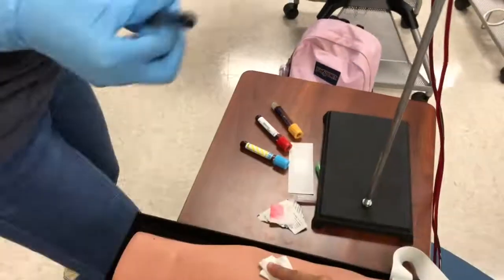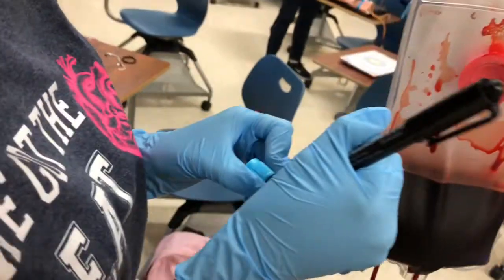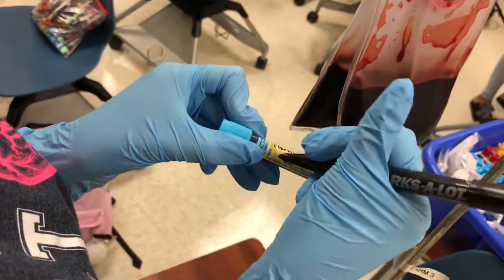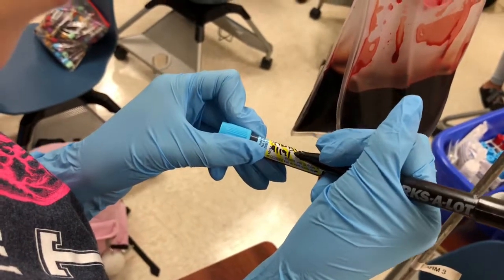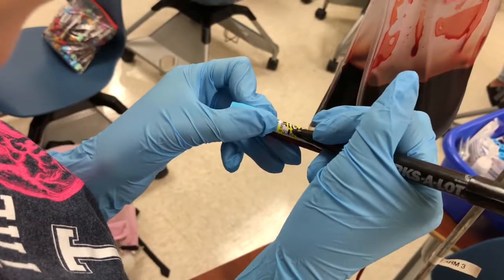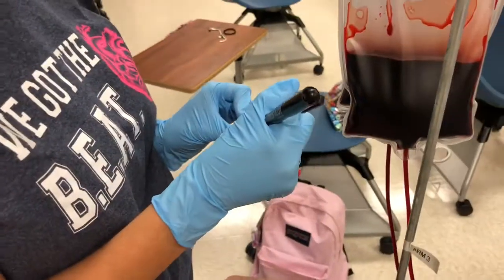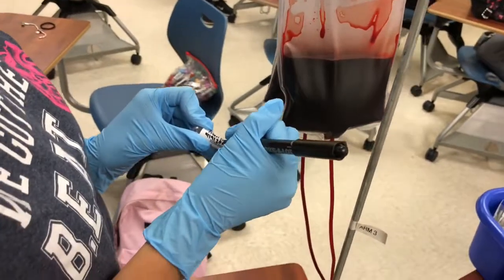I get a marker so that I can label the tubes. I write the patient's name — Clarissa Jaramillo — and her birthday, 9/19/2000, and today's date, 11/15. I use this with the red and yellow tubes as well, making sure that they all have a label so that the laboratory knows what patient the blood belongs to.